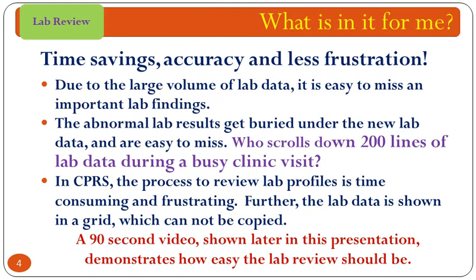What is in it for me? Time savings, accuracy, and less frustration. Due to the large volume of lab data, it is easy to miss important lab findings. The abnormal lab results get buried under the new lab data, and are easy to miss. Who scrolls down 200 lines of lab data during a busy clinic visit?